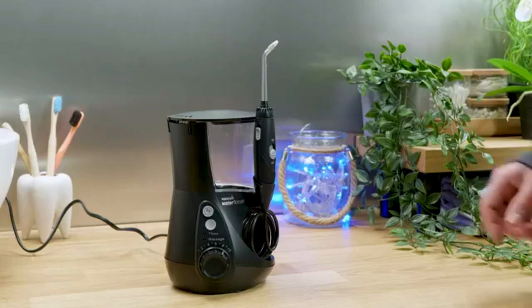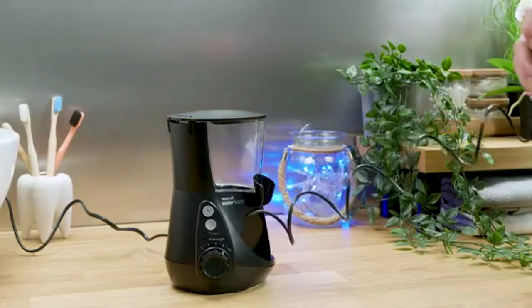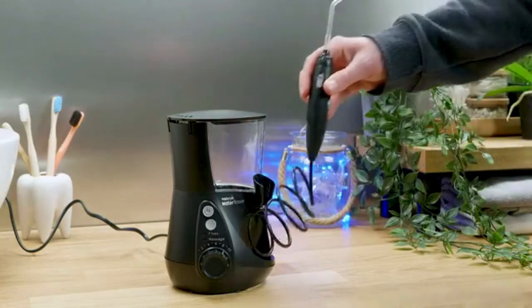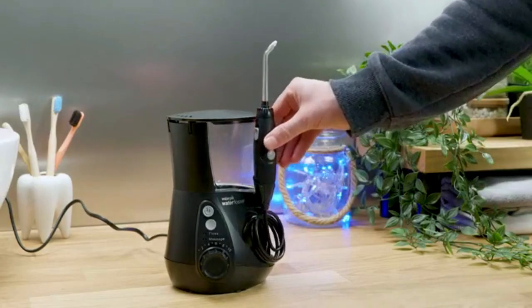The Aquarius is pretty compact all things considered, but if space is at a real premium in your bathroom then it might not be ideally suited to you. You need a space of approximately 6 to 8 inches square on your countertop to accommodate it. It also requires mains power — it needs to be connected to the wall outlet to function. There is no battery inside this unit.